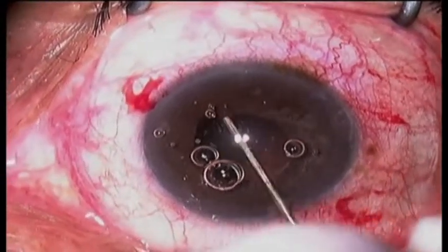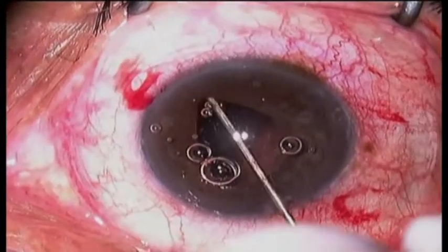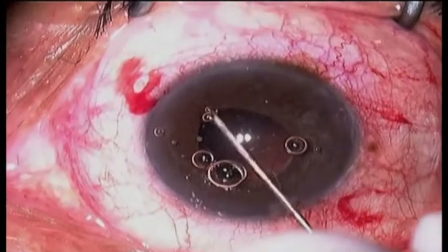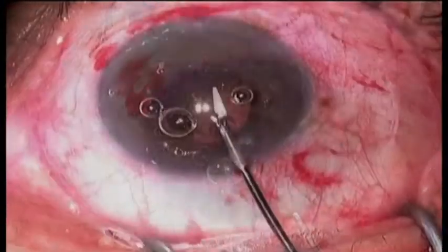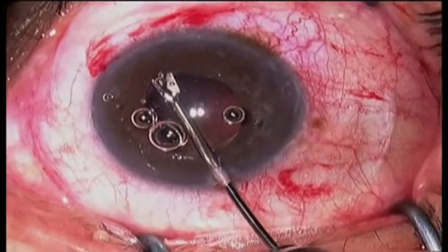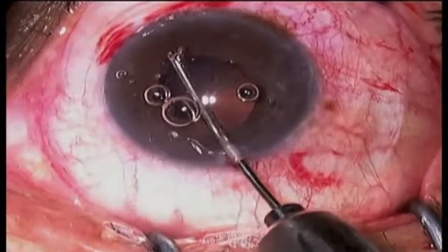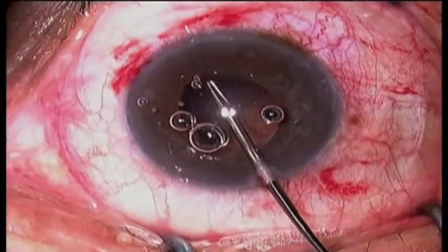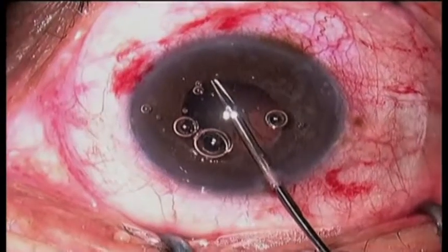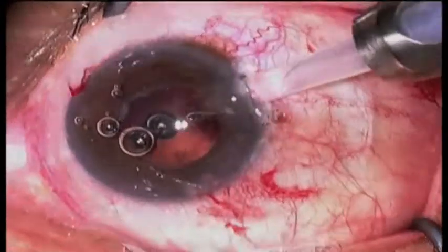At this point it is obvious that there are adhesions between the peripheral iris and the capsule. At first I attempt to break these with a blunt instrument, but a decision is made to cut them with a 23-gauge micro scissor. This is done by taking the scissor and pushing it up against the undersurface of the iris so you don't break the capsule, and then making a snip and sweeping from side to side.